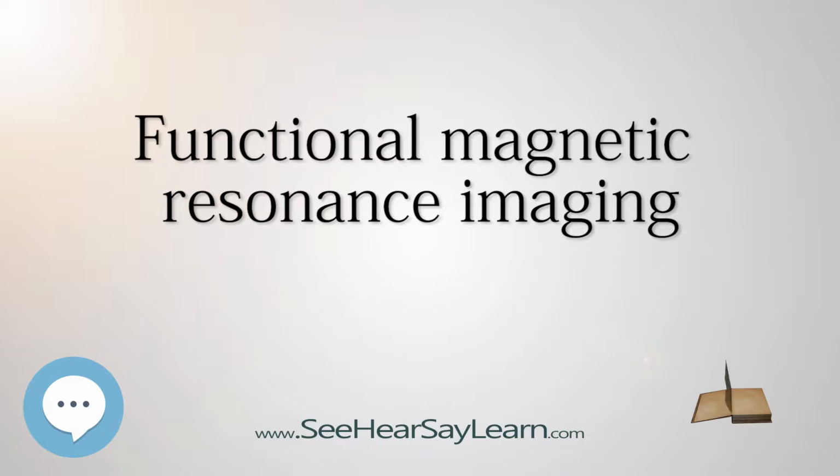by brain cells. Since the early 1990s, fMRI has come to dominate brain mapping research because it does not require people to undergo shots or surgery, to ingest substances, or to be exposed to ionizing radiation. This measure is frequently corrupted by noise from various sources, hence statistical procedures are used to extract the underlying signal.